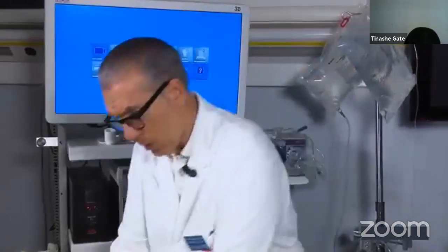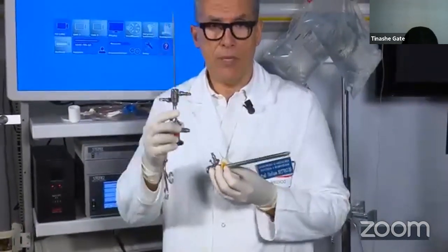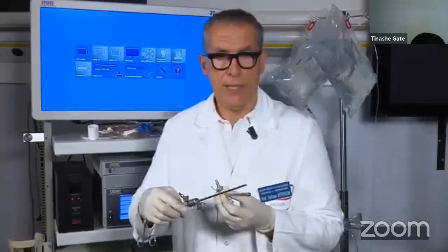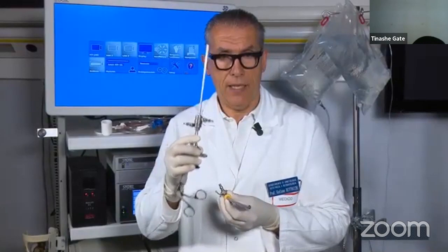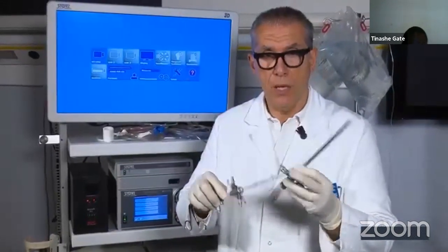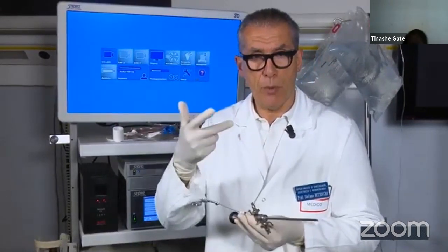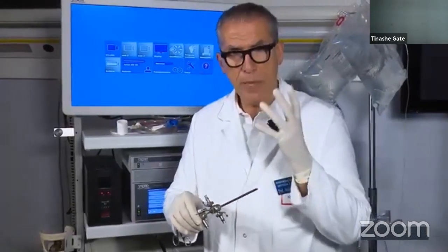So this is our syringe without the needle, and this is our syringe with the needle. The output channel of the resectoscope and other large instruments is much, much wider than that of the normal office hysteroscopes. So to let the fluid pass through these small diameter scopes, you need a lot of force, like the force I was putting on my finger to push the piston and let the liquid go out. So this is the basic concept.